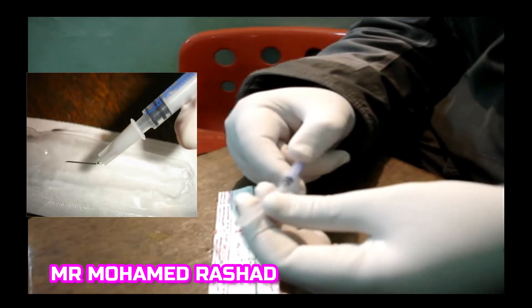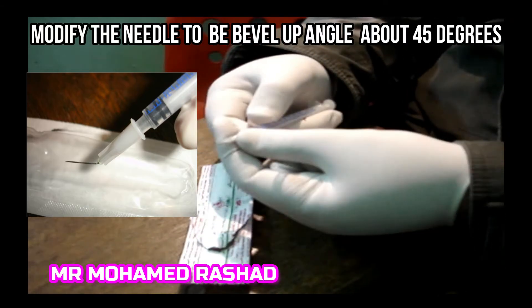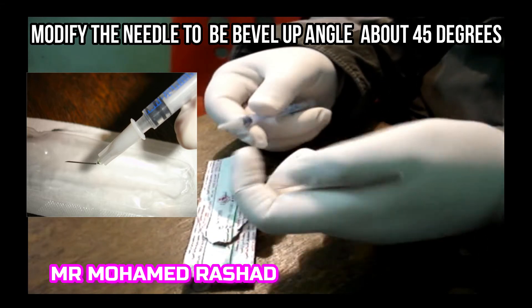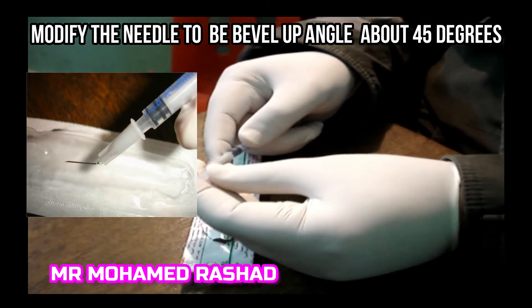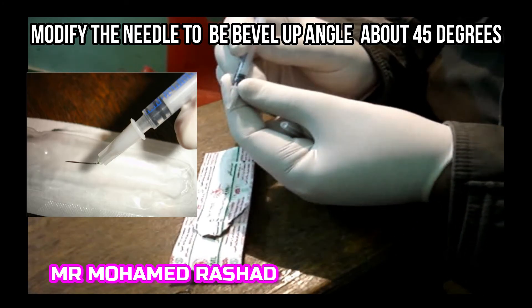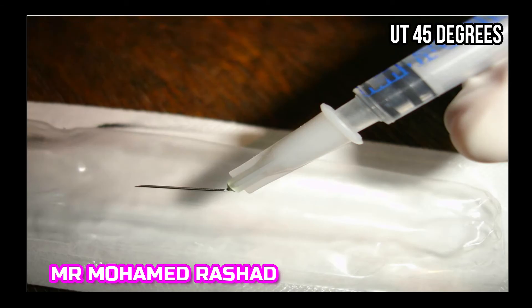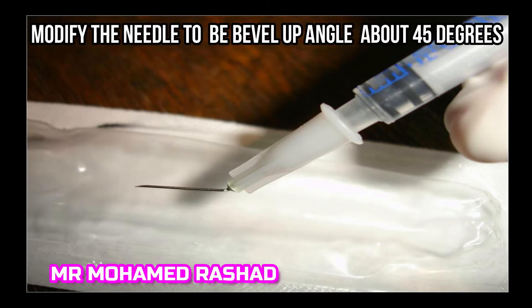This is a modification I use for the needle to make it easier when working at the slit lamp. The bevel is up and I bend the needle about 45 degrees, just to make it parallel to the surface of the cornea, as shown in this picture.